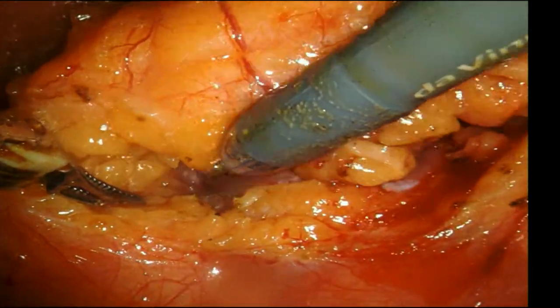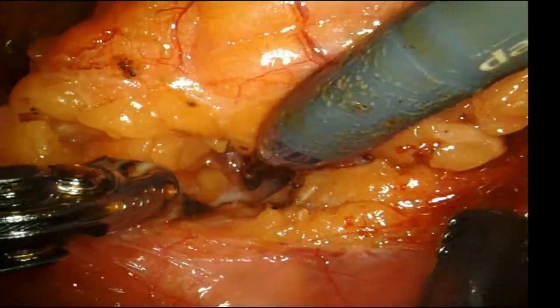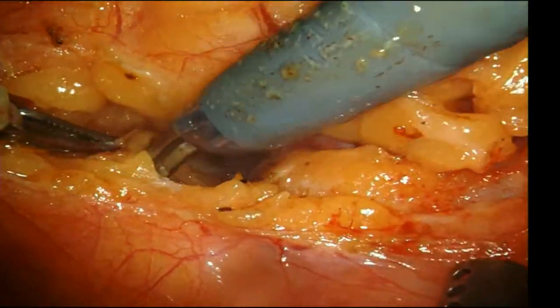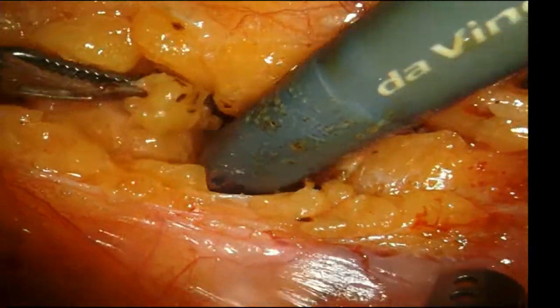Yeah, that's why I was saying, you know, 90% of the case is set up. If you try to cut corners, you pay for it when you go on clamp. So, you know, take the time that you need to set it up, clean off as much fat as you need to see what you need to see, not only to cut the tumor out, but also to reconstruct the kidney.